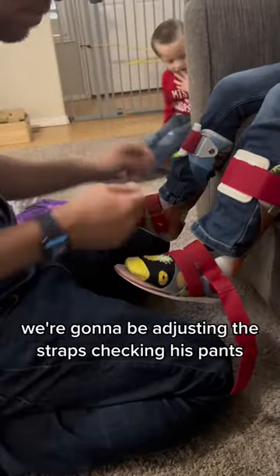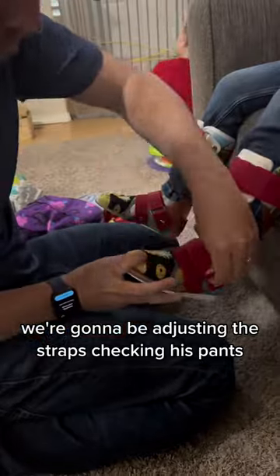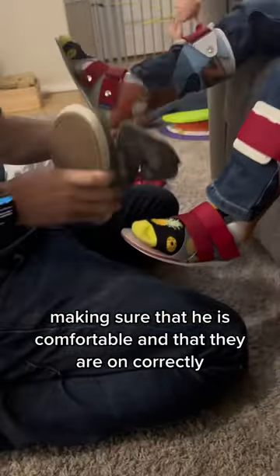So now we're just adjusting the straps, checking his pants, making sure that he is comfortable and that they are on correctly.